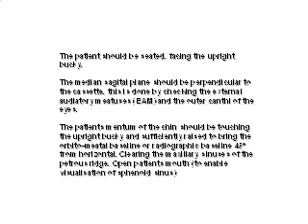If the extension is not adequate, the superior border of the petrous pyramid will cut through the maxillary antrum and give a false suggestion of a fluid level. If this is suspected, then the X-ray should be repeated with adequate extension so that the superior border of the petrous pyramid is away from the maxillary antrum and is at the inferior edge of the antral lining.